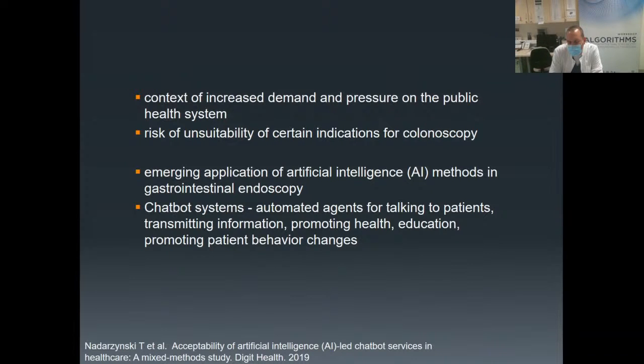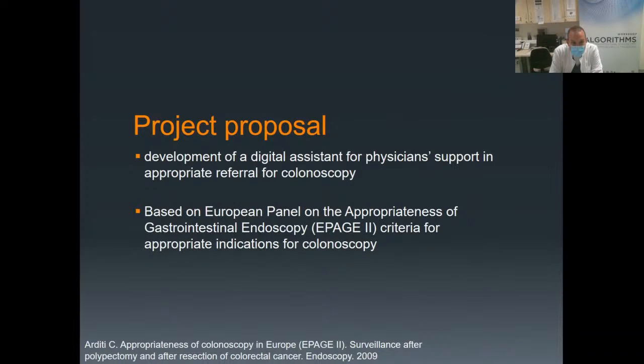One of these systems is chatbot systems, which are primarily used for talking to patients, transmitting information, promoting health and education. Next slide. So, our proposal is to develop the digital assistant for physician support in appropriate referral for colonoscopy. And this artificial intelligence-based system will be based on the European panel on the appropriateness of gastrointestinal endoscopy criteria for appropriate indications for colonoscopy. Next slide.